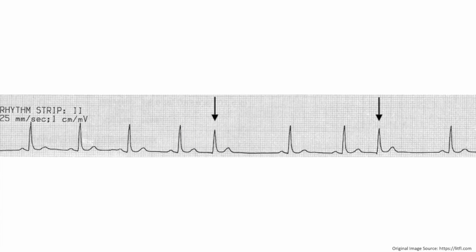Now in this example, we can see that there is the P wave, the P wave, the P wave, and then you have a QRS but no P wave. And the same thing is true with this beat. So the hidden P wave is probably within the QRS. From this EKG, it appears that these beats, because they're appearing sooner than expected, would be premature junctional contractions.